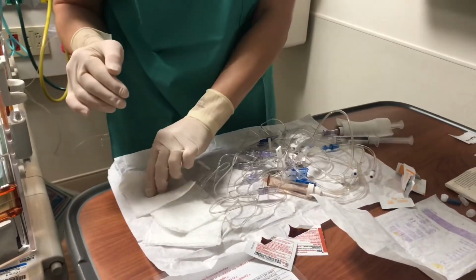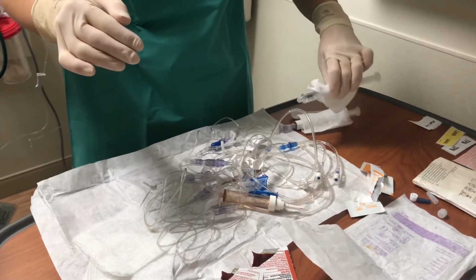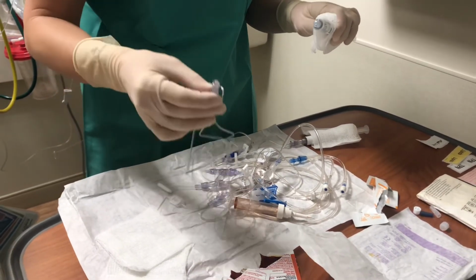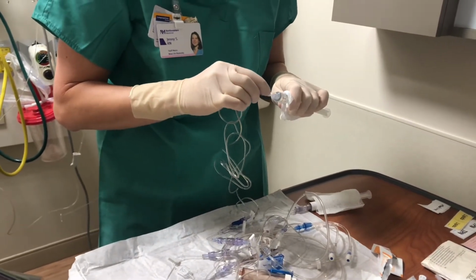Okay, next I'm going to take another sterile 4x4, and I'm going to grasp my saline syringe, and then I'm going to put that on the end of my medline tubing.